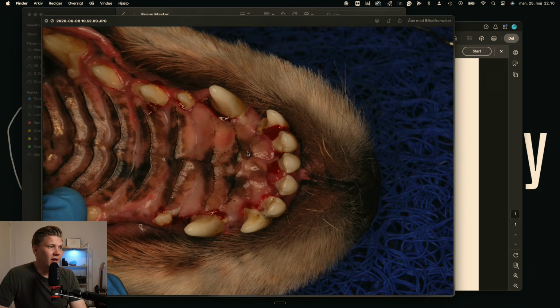If you have a look at right here, these are the incisors. This is right after some probing. I only did some probing with the periodontal probe, and when you see bleeding like this, you have to mark G2 on your dental chart, which means gingivitis grade 2, because it's bleeding. And if it's bleeding on probing, then you have disease. You have gingivitis and possibly also periodontitis.